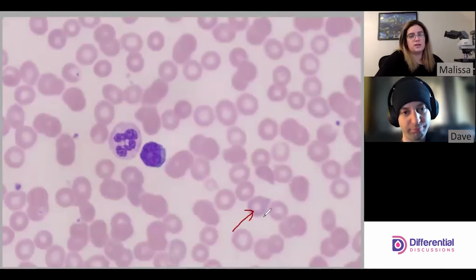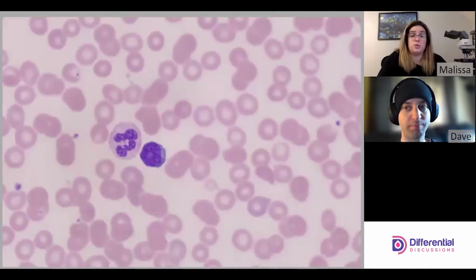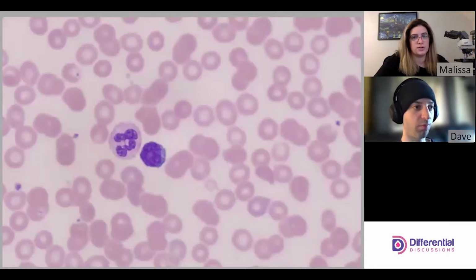So I think that's actually an important thing to distinguish when we talk about macrocytic disorders. The hypersegs are particular for DNA synthesis, which is the B12 and the folate deficiencies. And if you just have a macrocytosis that's associated with liver disease, reticulocytosis, being a newborn, then you're not going to see those hypersegs, and it's more associated with, well, it depends on which disorder, but reticulocytosis in newborn is having those retics. So I think it just depends on the cause, what you're going to see. But if you see hypersegs, typically there's a DNA synthesis issue happening.